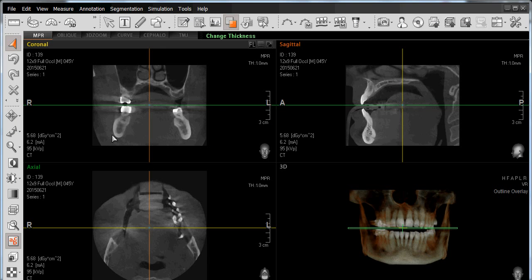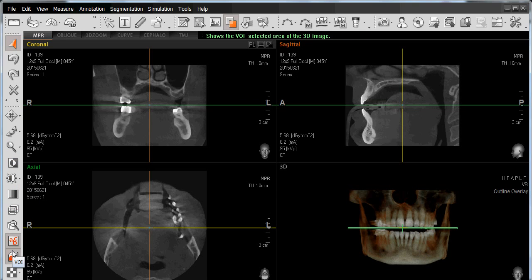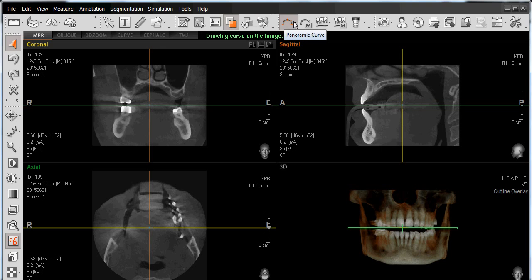Let's spend some time identifying the tools and functions of the 3D software itself. You'll note that there are icons displayed along the left-hand side of the screen and icons displayed along the top of the screen, which identify the most common features and functions of the 3D software itself.